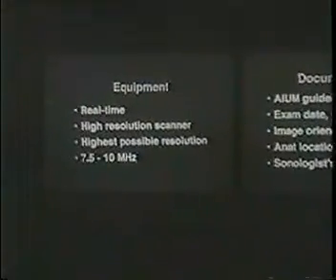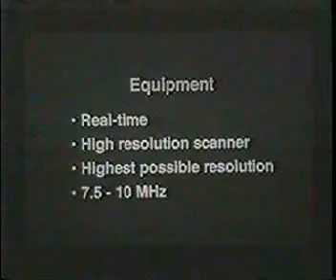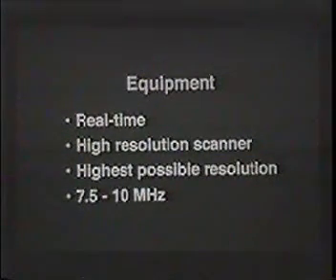Recently, in an attempt to standardize the performance of breast ultrasound, since it's now an accepted part of breast imaging practice, the AIUM and the American College of Radiology Breast Task Force have developed guidelines for the performance of ultrasonography. And I think this is an important step forward, since there is a variety of ways it's practiced, and many practitioners are looking for advice and guidance.